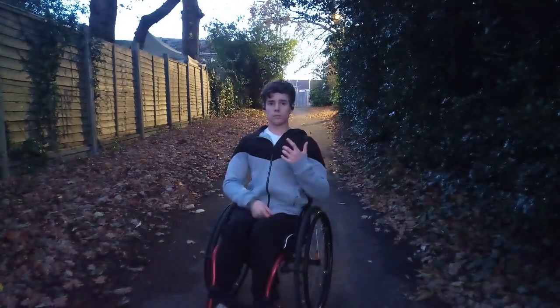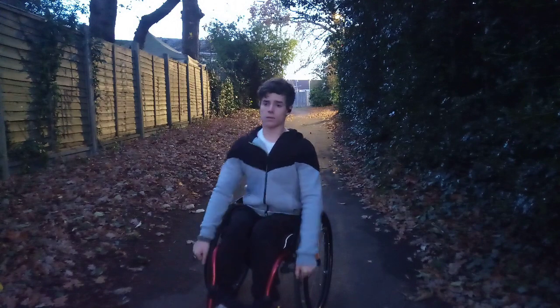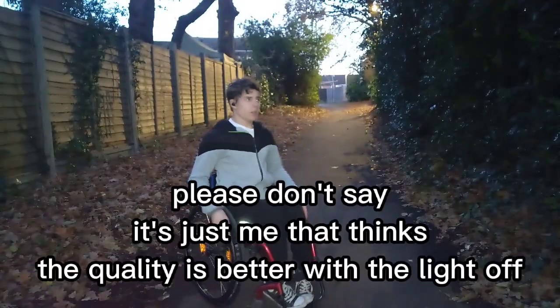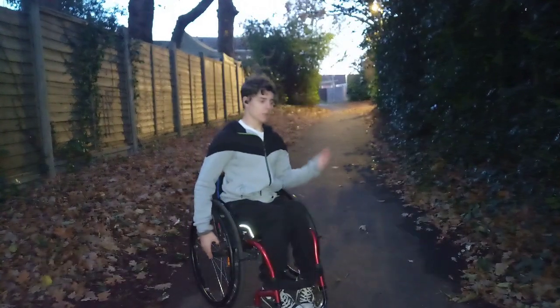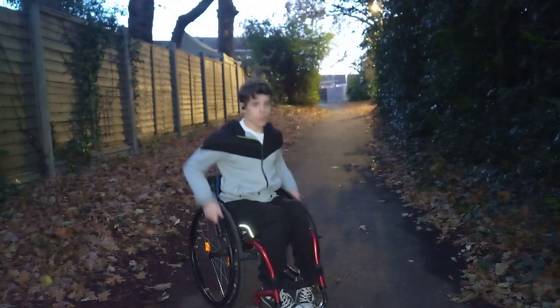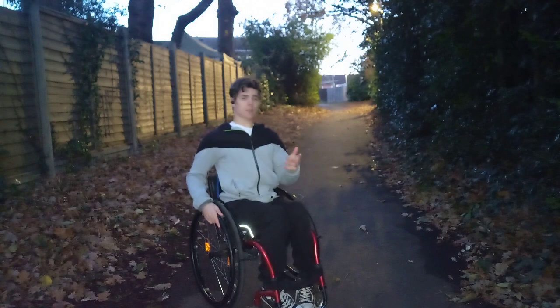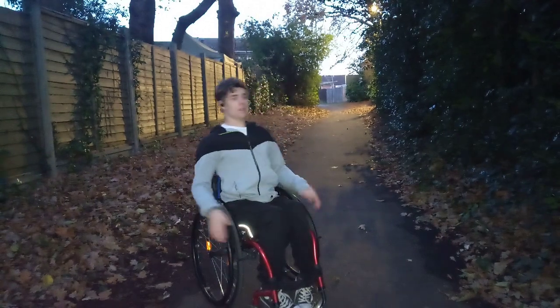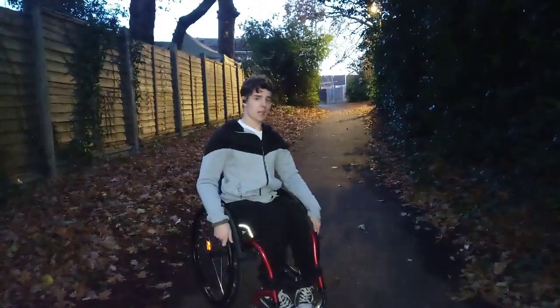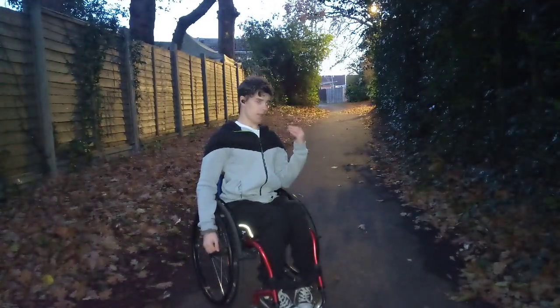Since you're going to be spinning a lot, I'd recommend being big brain and turning on the light. Pushing along, the wheels will slip and spin before even getting to move. So what I'd recommend is some short, shallow pushes just to get you going. In the first wheelchair skills video that I did, I said to give big and efficient pushes, but on the ice, you want to get your wheels spinning as quickly as you can, just so you can start to move. At least that's what I'd recommend.